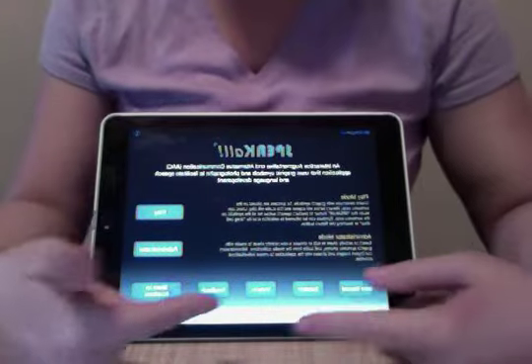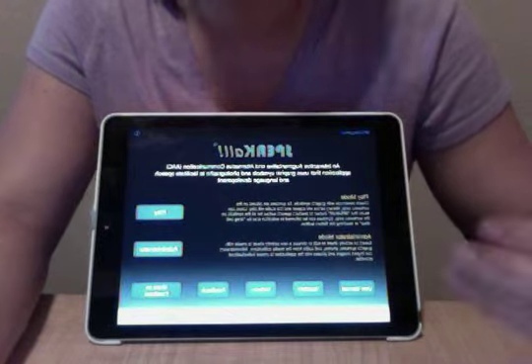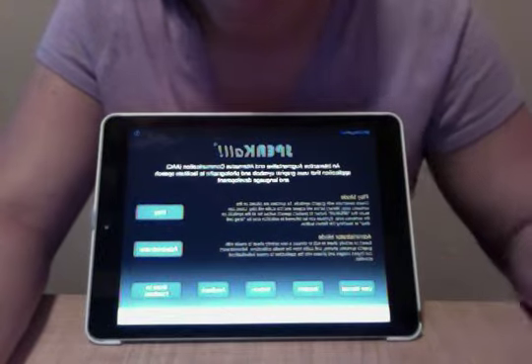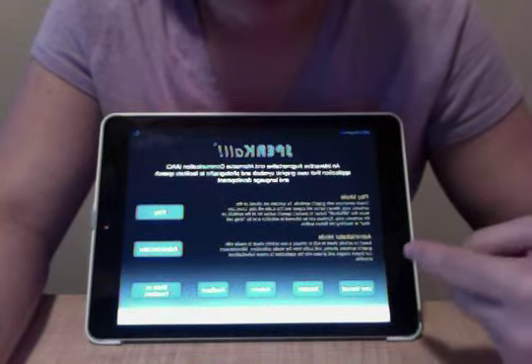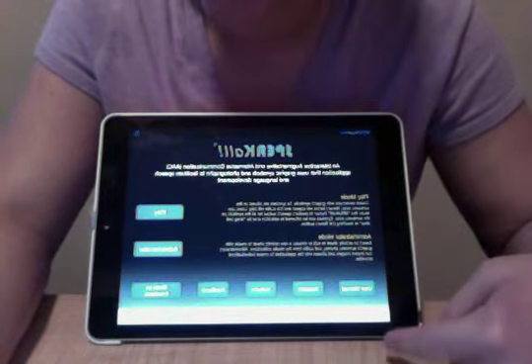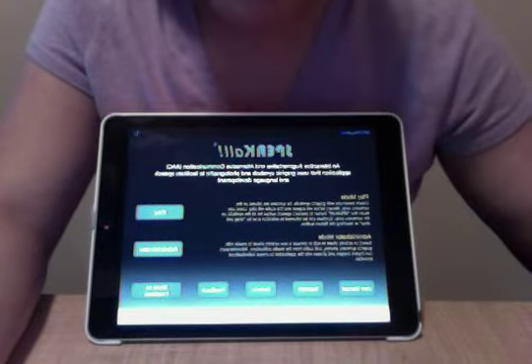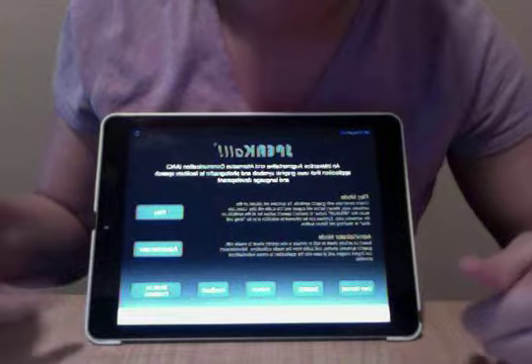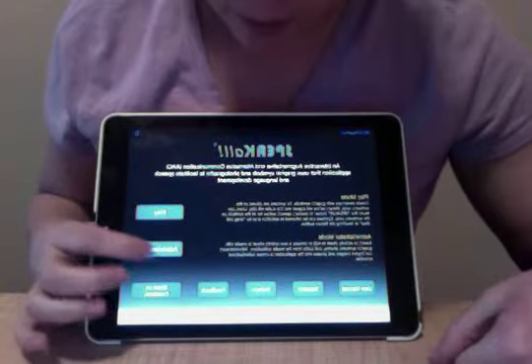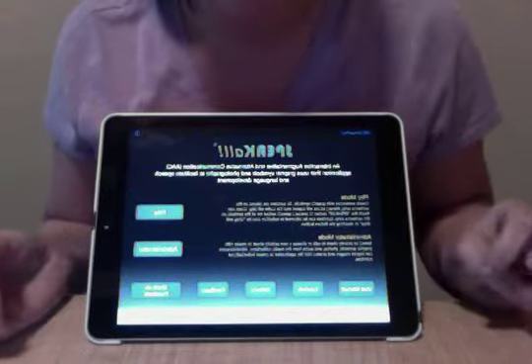There are a lot of different categories, like needs, so the ability to comment on things. So you can either do one-word mands or tacts for your early learners, or you can move up to combining them with the SpeakAll button, which we'll get to in a second. And then administrator mode is where the really cool things come into play, because it's infinitely customizable.